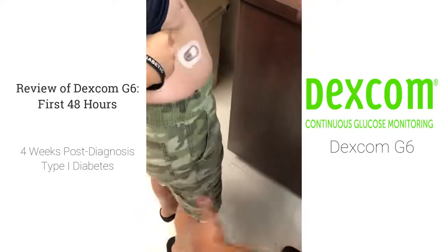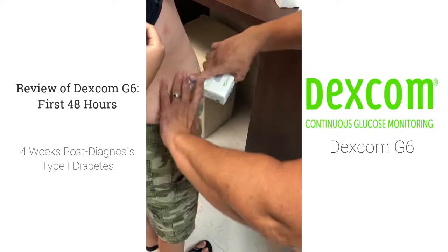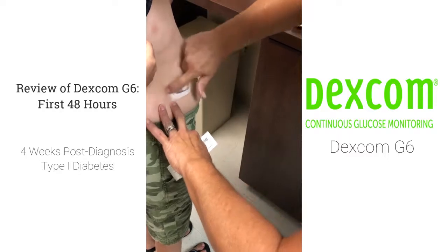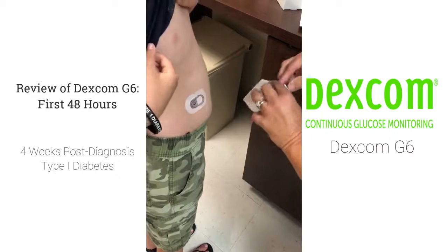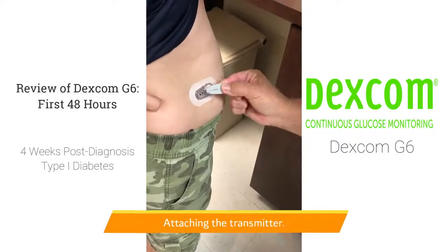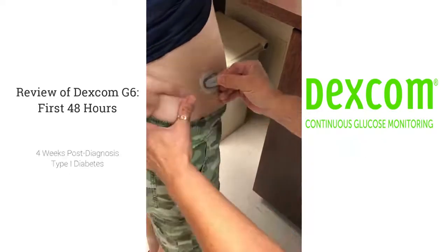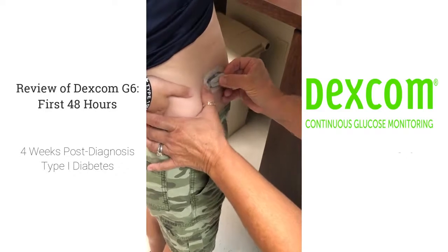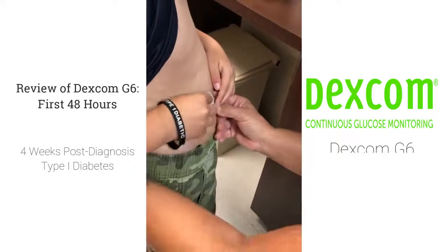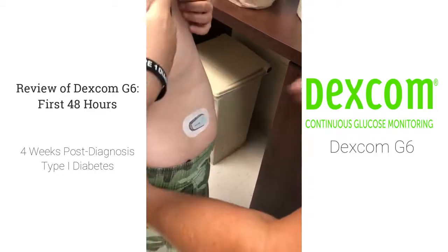It scared you, but that's it. Did it hurt? No. I told you it wasn't going to hurt. So you already got your sensor in — this is your sensor. Always rub around here so that the tape sticks on really good. Now, this is your transmitter — this little piece. See how this goes up and down? It's like little teeth; you stick it in there like that. It has to come out through here. I'm going to give it to you — you put it in. Click it in hard. Push, push, push. Click. You're done. Not bad, huh? No.